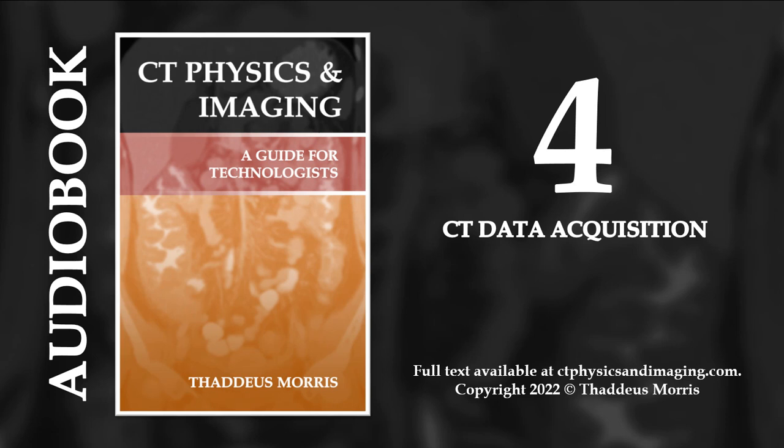Scan type. CT has 3 distinct scanning modes: axial, helical, and volume. The resulting images look virtually identical, but the scanning processes are very different. Axial scanning. This is the oldest mode of CT scanning, but it continues to be a valuable scanning mode for numerous protocols. Axial scanning is also called sequential scanning because the data is collected one section at a time.